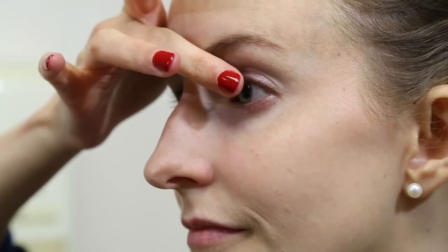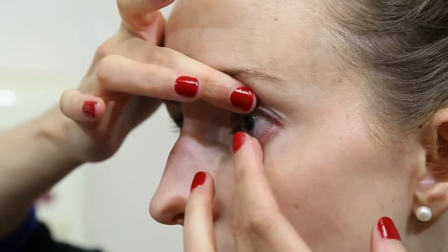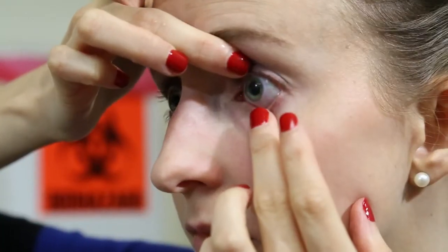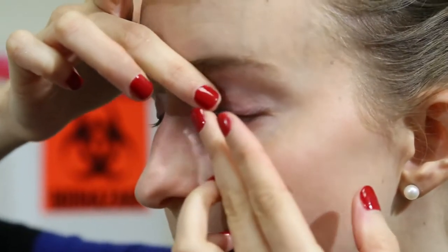For the removal of your rigid gas permeable contact lens, look in the mirror. Position the lid at the lash line of both the upper and lower lids using your fingers. Position the edges of the lids on the edges of the lens and gently press the lids in and towards each other to squeeze the lens off the eye.